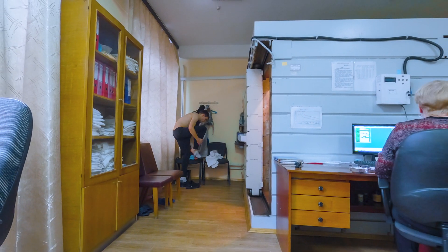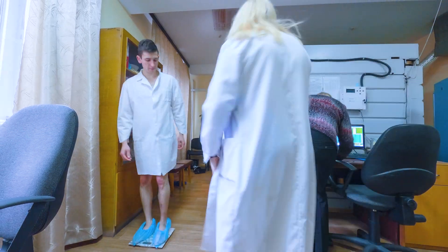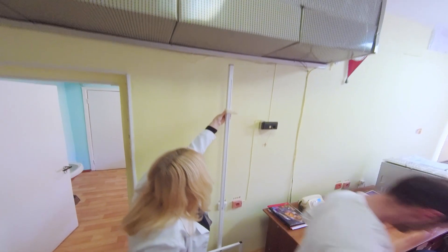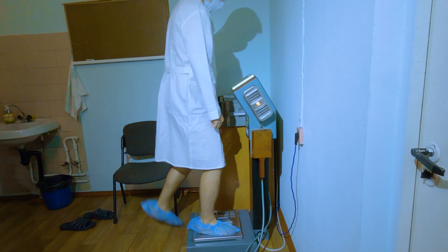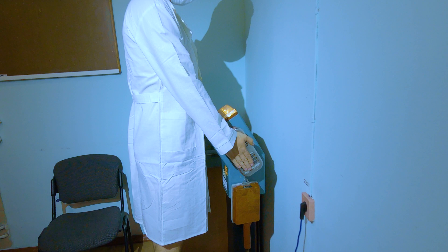Hi everyone, today we talk about the human body radiation counter — this big metal thing on your screen. Everything starts over here at the Kyiv Nezytomirska station. This counter was used a lot after the Chernobyl nuclear accident, for the liquidators and for the people who were victims of the accident.